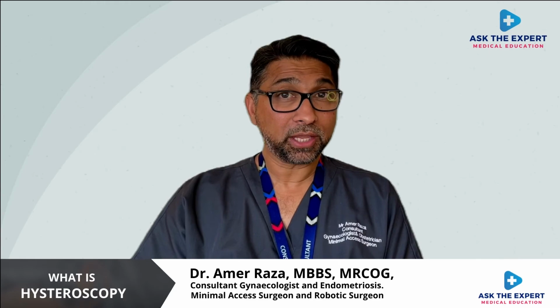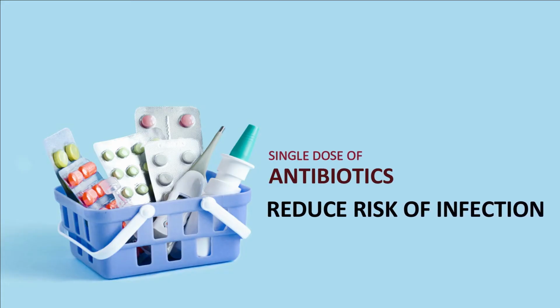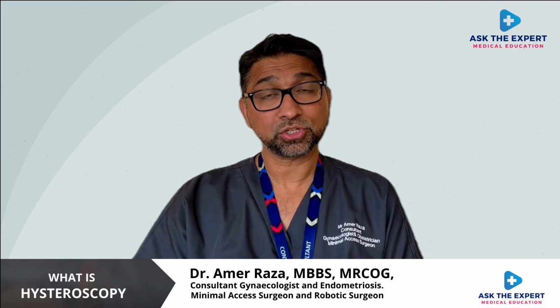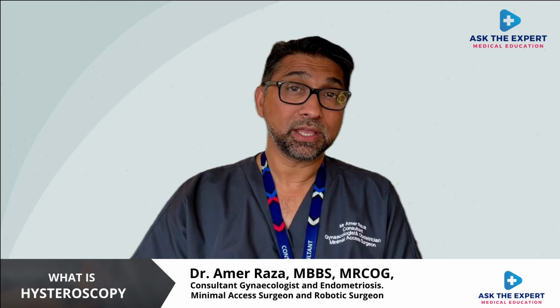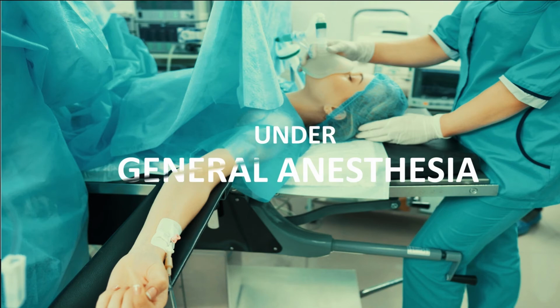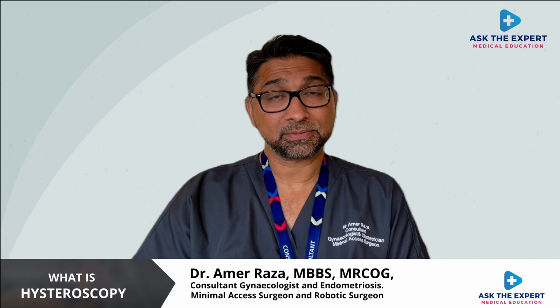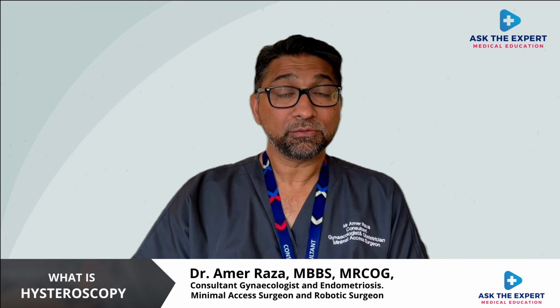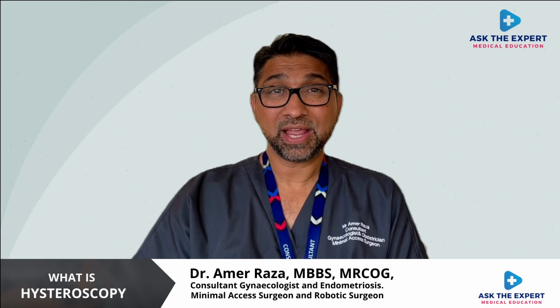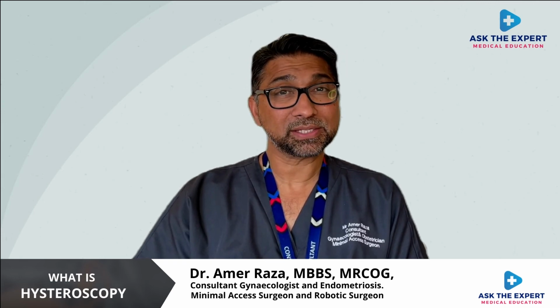In all childbearing age women, it is best to have a single dose of antibiotic to reduce the risk of infection. However, the risk of infection is quite low in outpatient hysteroscopic procedures. Now, in comparison, the alternative option is to have a hysteroscopy under general anesthesia. General anesthesia carries its own inherent risks. And there are some procedures which have to be carried out under general anesthesia, such as a large fibroid uterus, extensive uterine adhesions, or even endometrial ablations in some cases.